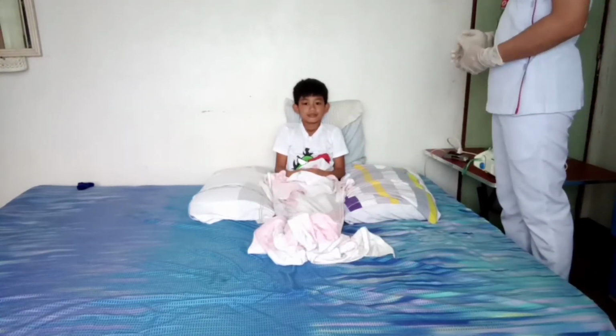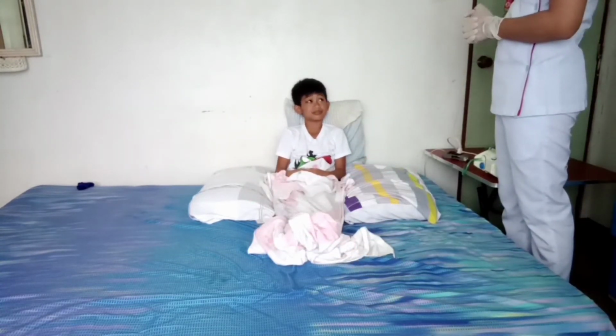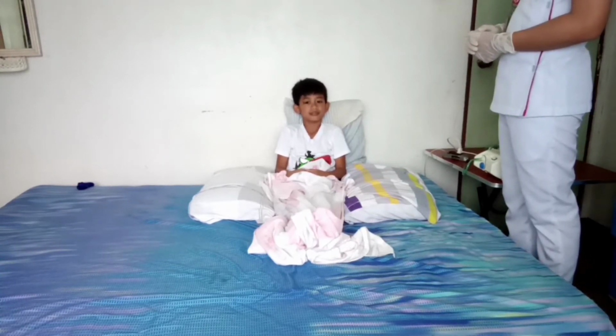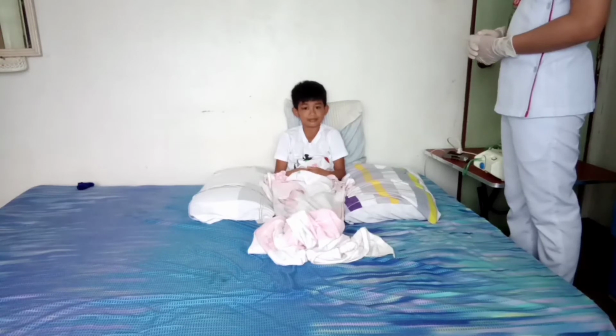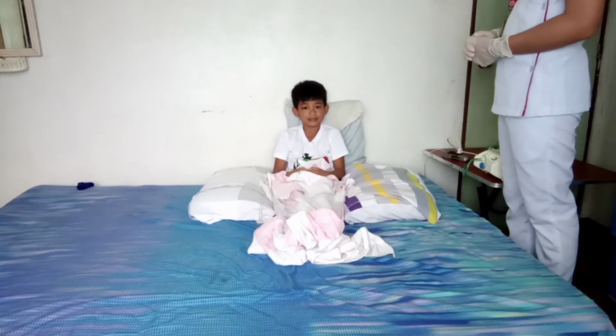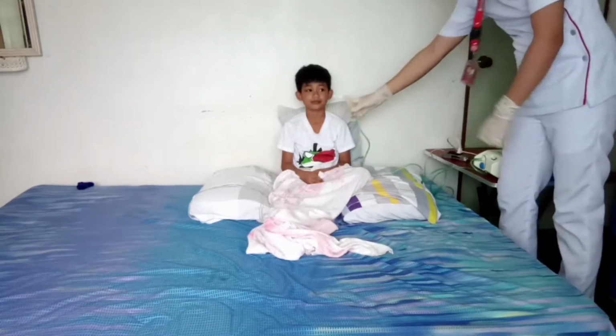And then instruct the patient to breathe slowly and deeply until all the medication is nebulized, approximately 15 minutes, when there is no more mist coming out. This is to maximize the effectiveness of the medication.